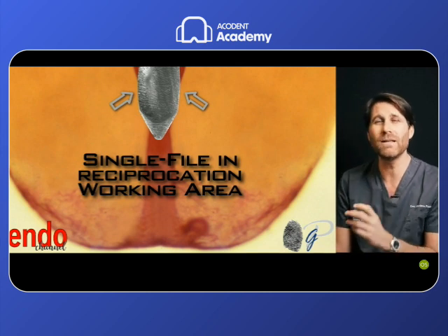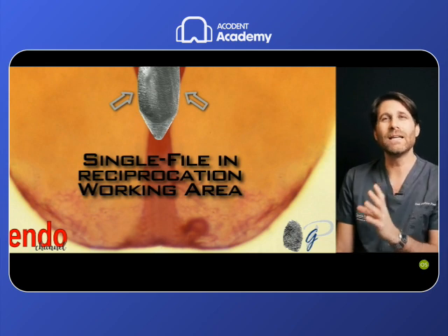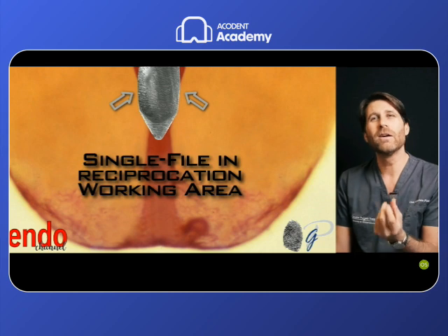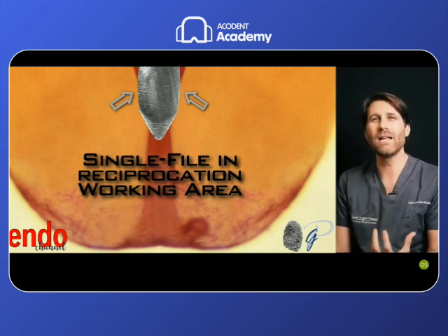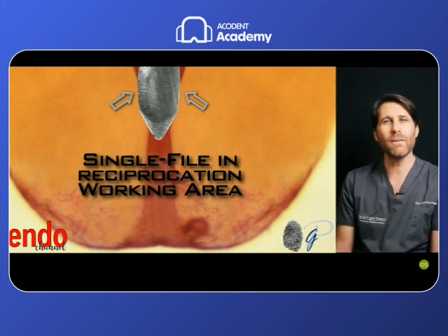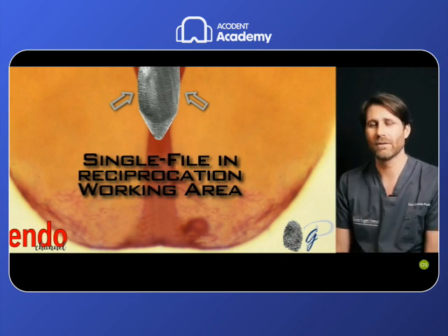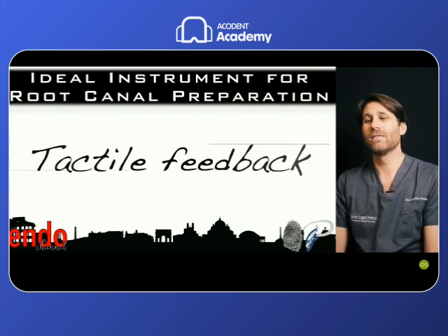A small tip in this case, we will see sometimes, or most of these cases, is too soft, too delicate, too small, too tiny to perform this. We need a more aggressive tip to remove and eliminate this coronal dentin that creates this anatomical path, this trajectory that is unscoutable to a manual scouting file. And this instrument gives you the tactile feedback.